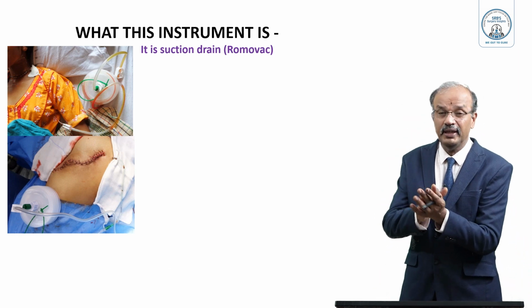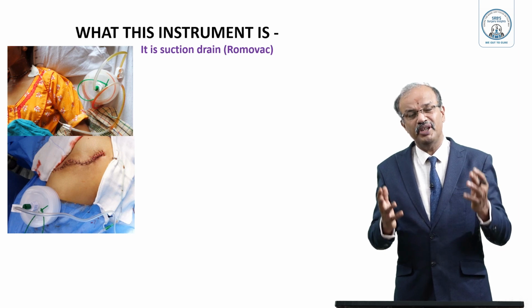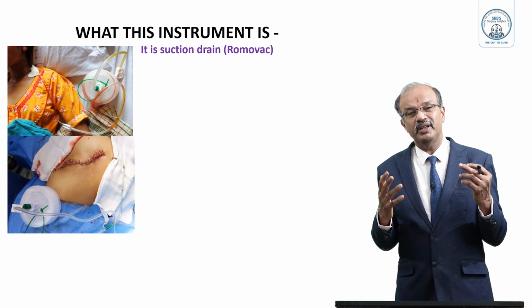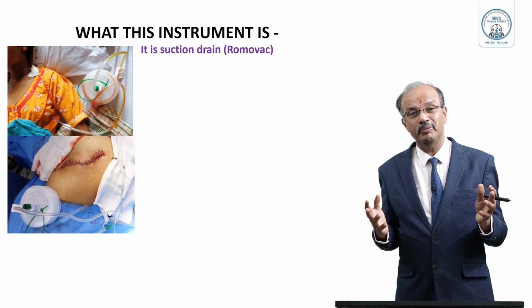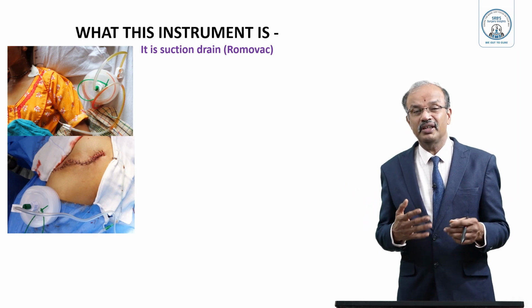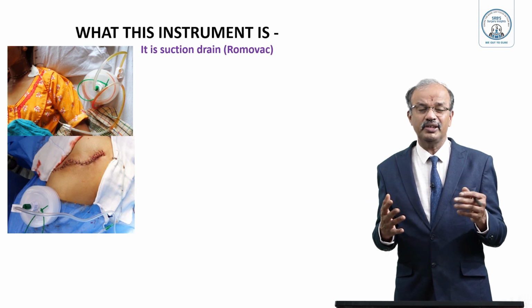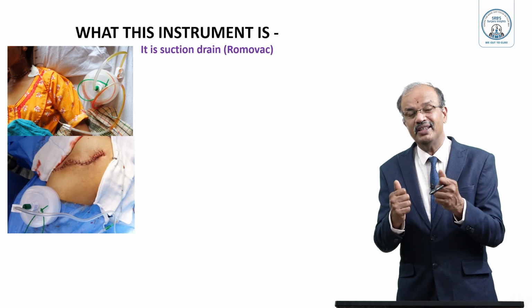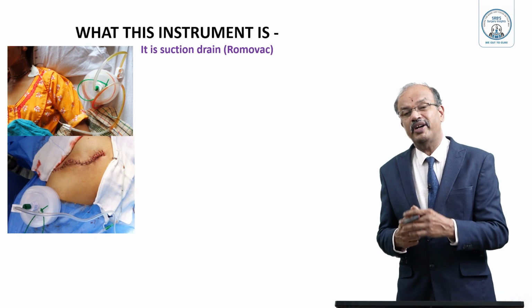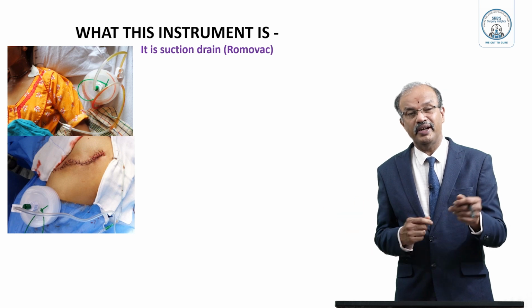It is easier to create suction, and it is used in thyroidectomy, used in mastectomy, and used in all surface major surgeries. This suction drain is the standard pattern nowadays. Different sizes are available, sometimes 2 loops are available. The drain is passed through a very strong steel perforating instrument and connected to that.